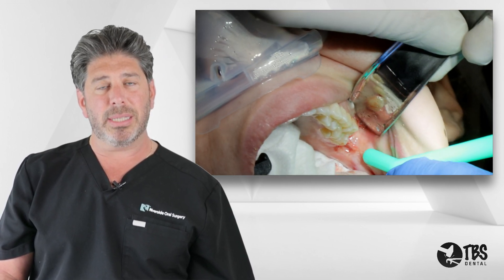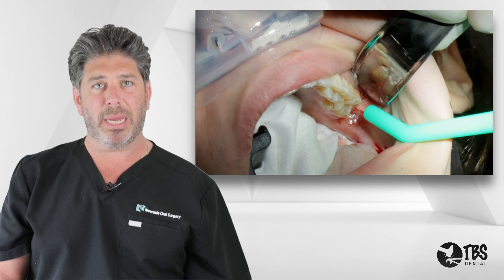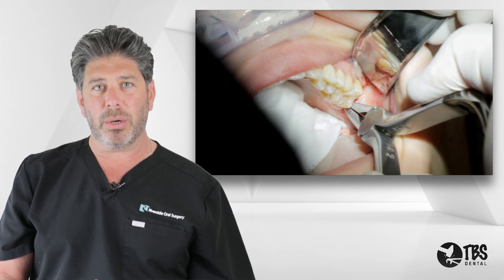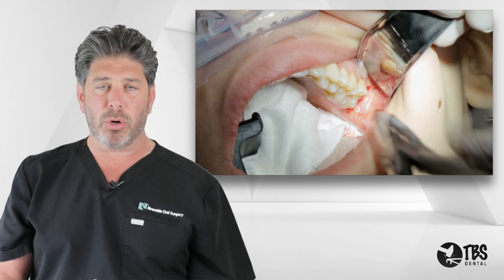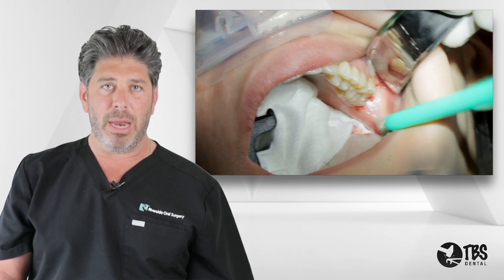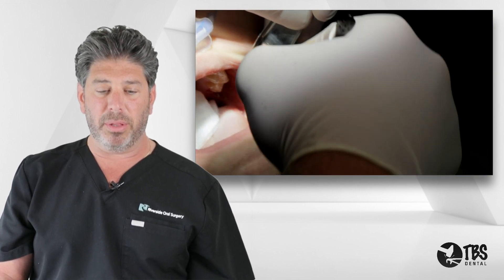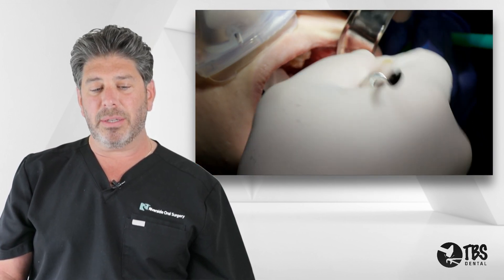After removing the third molar, I clean out and debride the socket of all soft tissue using a serrated double-ended spoon curette and a rongeur to remove the remaining tissue. We also clean up the bone, irrigate, and make sure the flap is back in place on its own. Then we go to the lower.